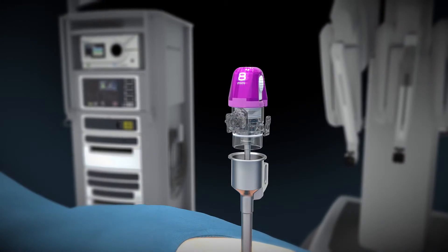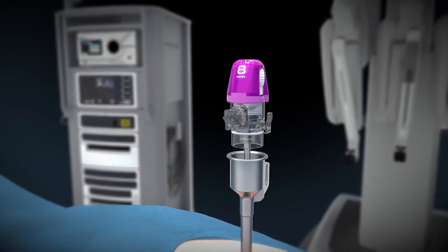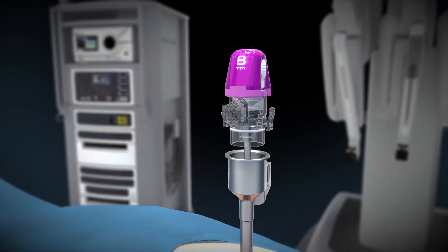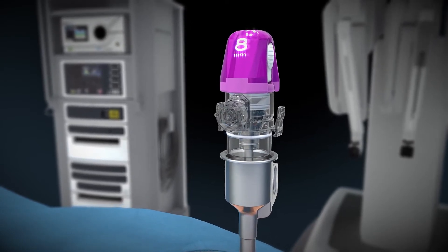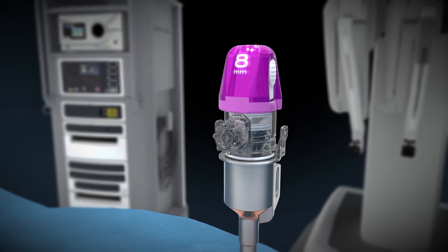To assemble the AirSeal cannula cap onto the 8mm robotic cannula, use the obturator to align the components, then push the AirSeal cap downward onto the cannula until an audible click is observed.